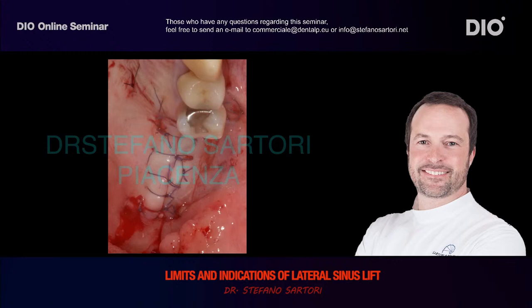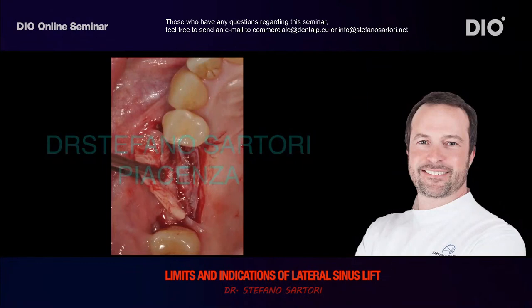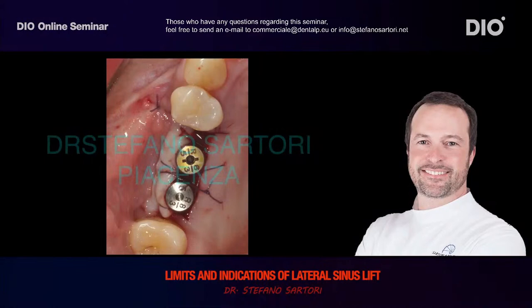Now is the time to perform the soft tissue management. Remember what I told you at the start with this case. The muscle insertion is very crestal. So, half thickness flap, moving a part of keratinized tissue from palatal to buccal. Look at this keratinized tissue. Look at the quality and the quantity of keratinized tissue buccal to the healing abutments. And remember, it's very important to perform a half thickness flap because I don't want to lose marginal bone.